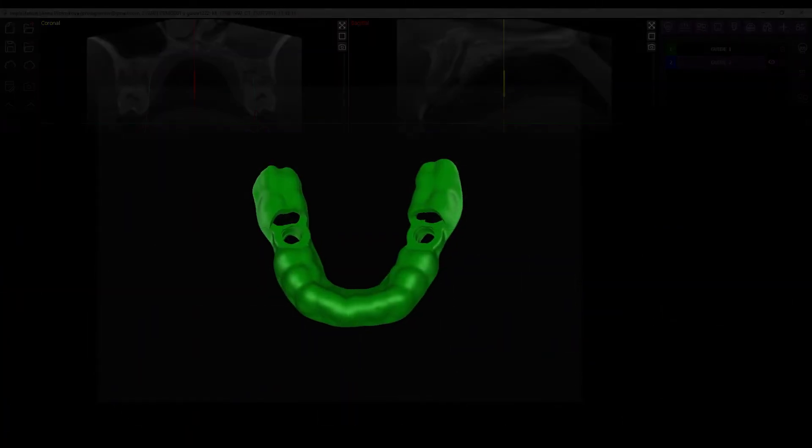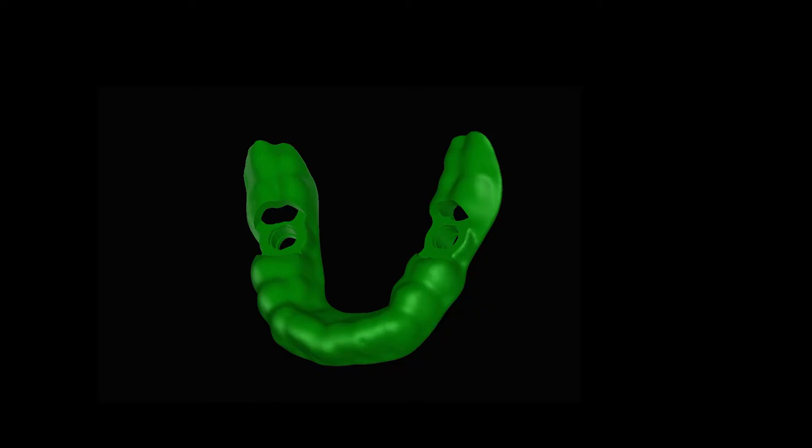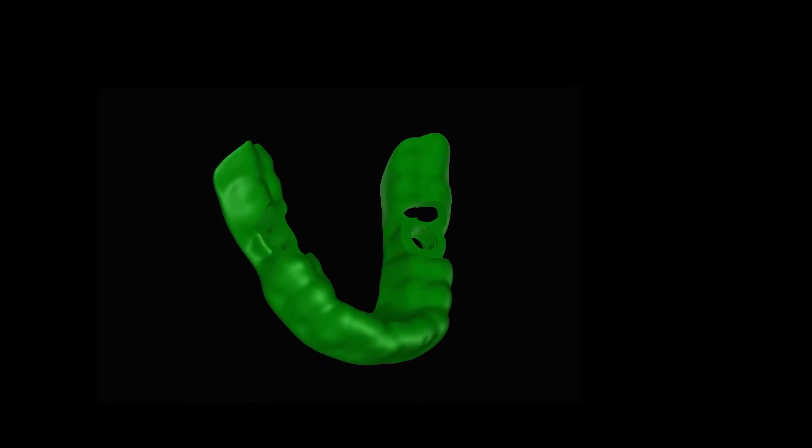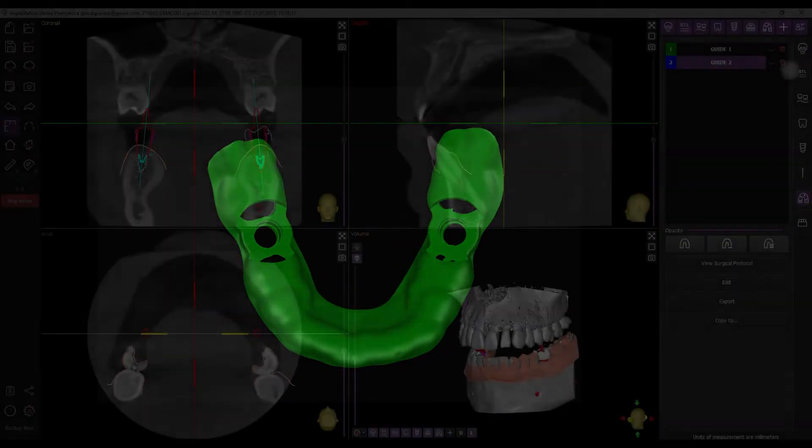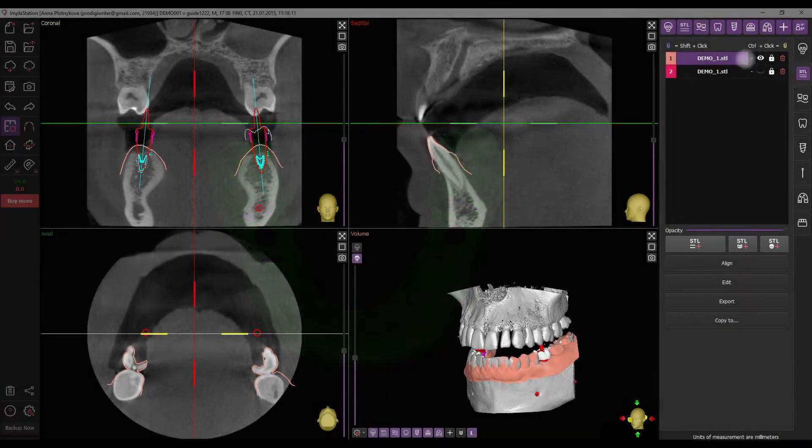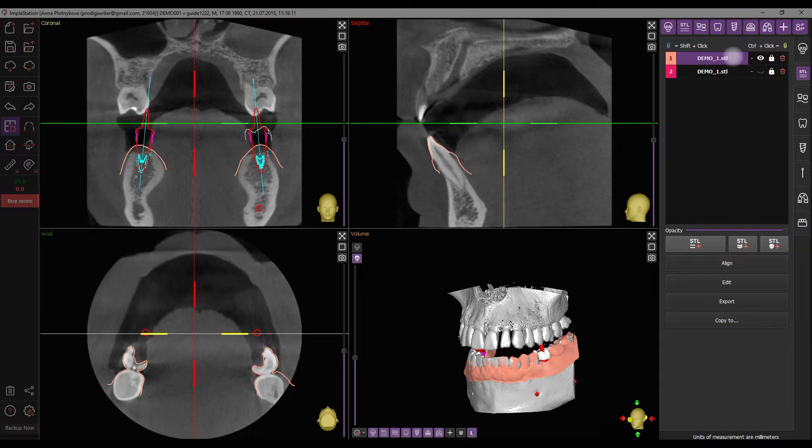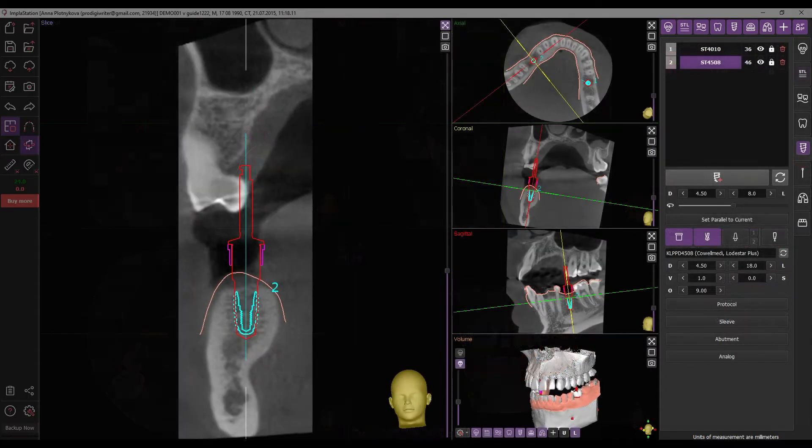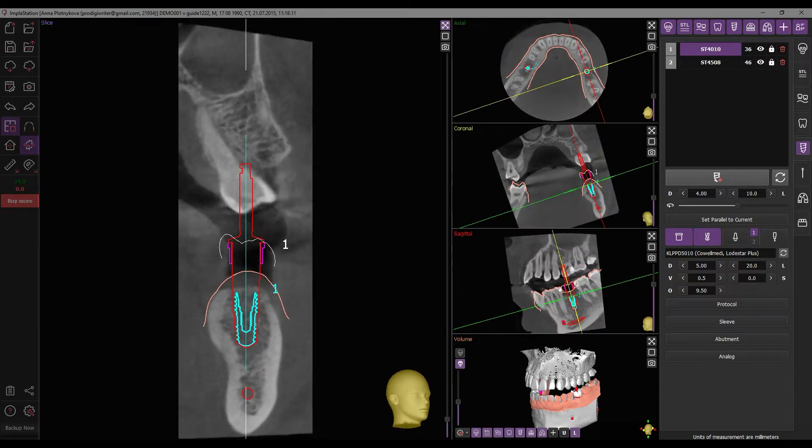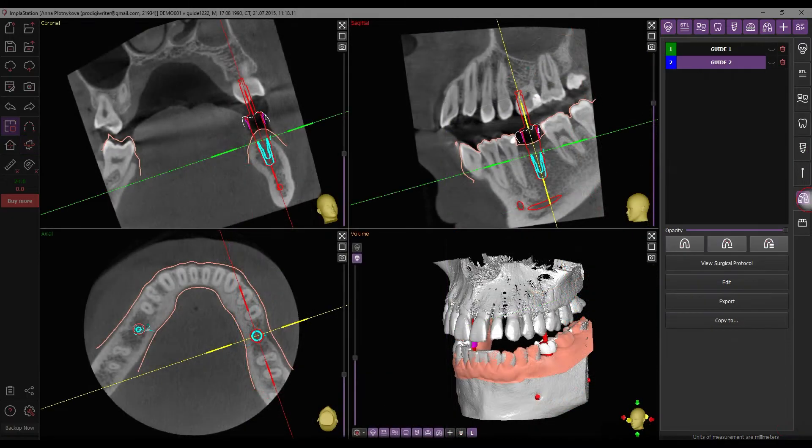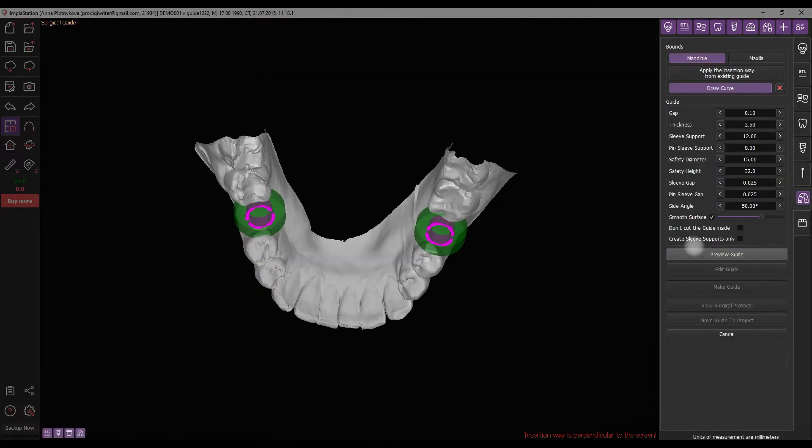Let's proceed to the process of creating the guide based on the surface. Begin by selecting the desired object from the list of STL surfaces and ensuring the accurate placement of guide sleeves. In the guide tab, click the relevant button to initiate the creation process. At the appeared window, start the guide setup.